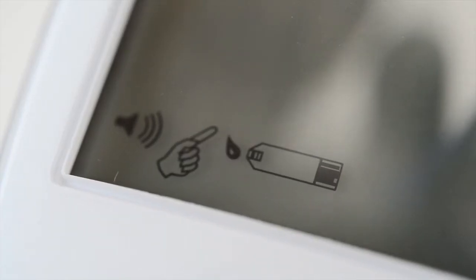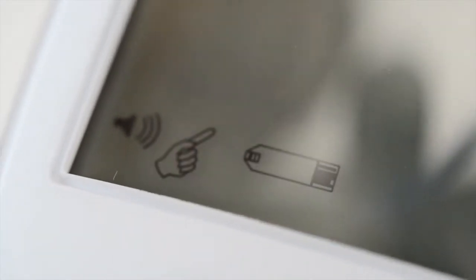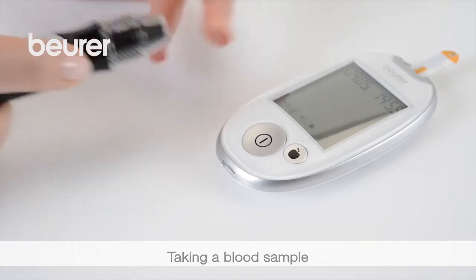The device switches on. The device is ready for measurement as soon as the hand and droplet symbol appear. Your hands must be clean and dry. Position the lancing device and press the trigger.